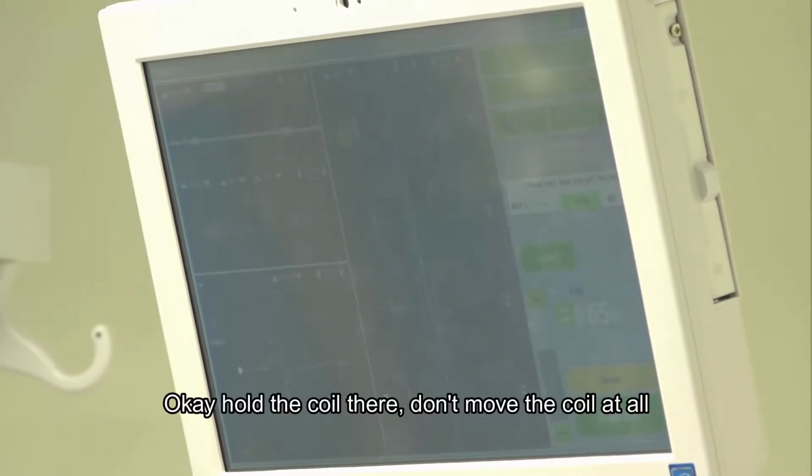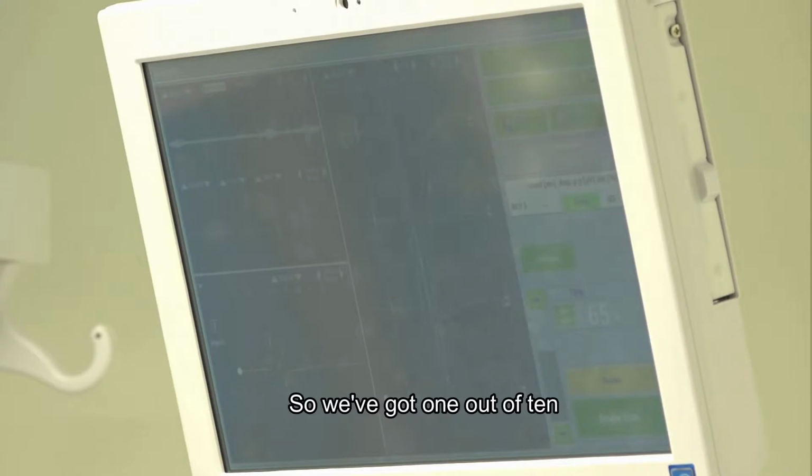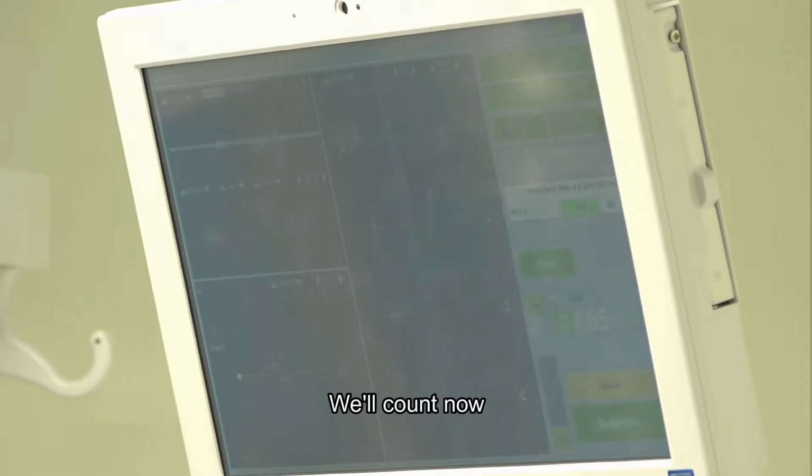Okay, hold the coil there. Don't move the coil at all. So we've got 1 out of 10. Keep going. 2 out of 10. It's all right, we'll count that. There's 3. Okay, that one's underneath, so that we've done. Keep going, so still 3 out of 10. 4 out of 10.